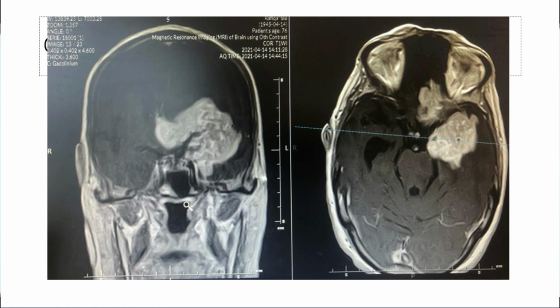We all know that. There are blood vessels. Sorry? It's a malignant tumor? Okay. Any other guesses? I'll say it's a benign tumor. Prove me wrong. Sorry? Diffusion restriction, yes. That will give us the idea.